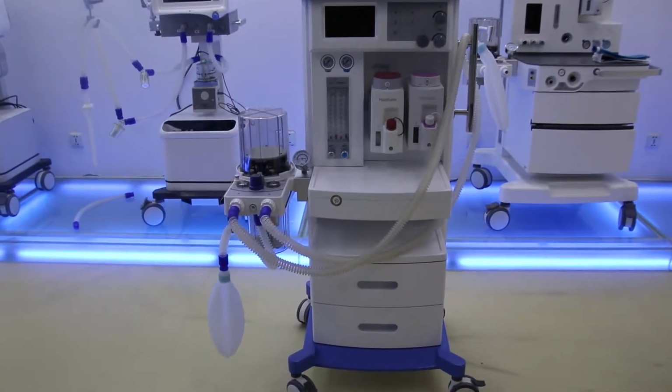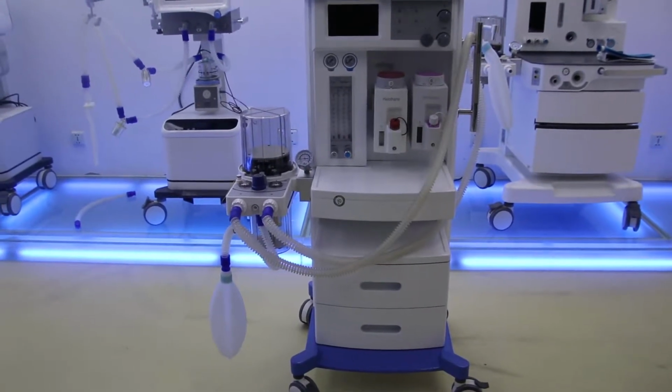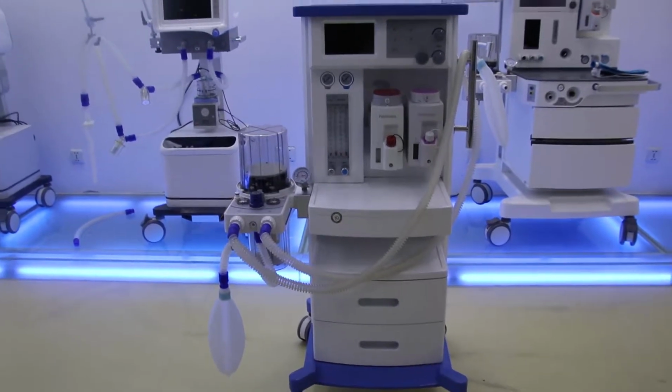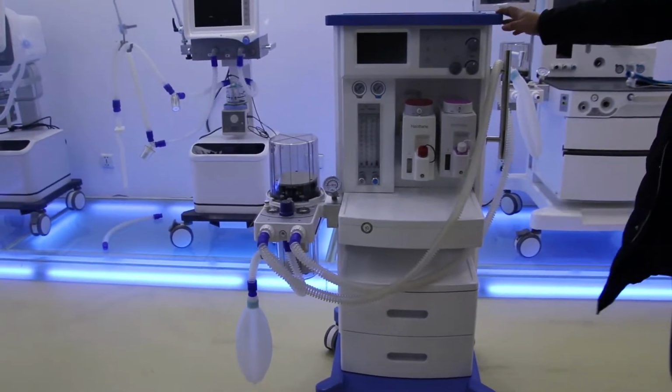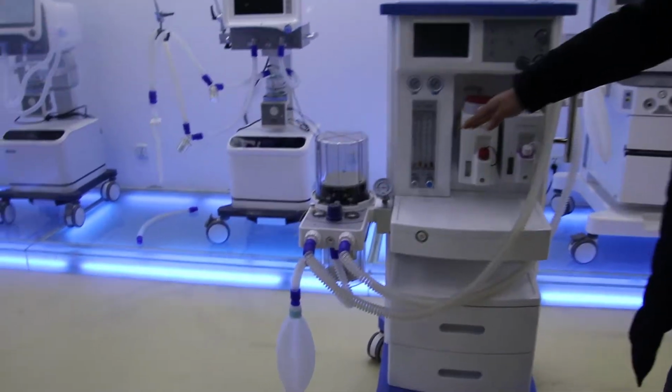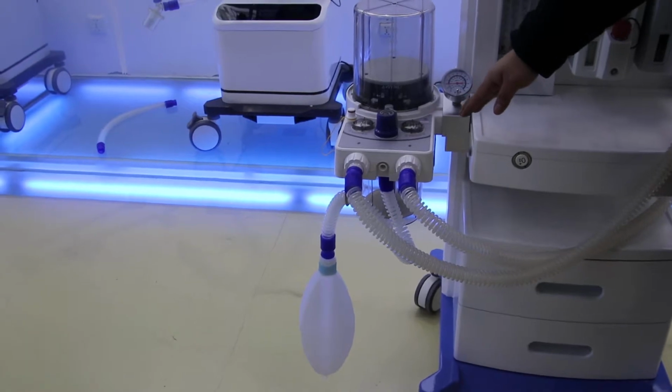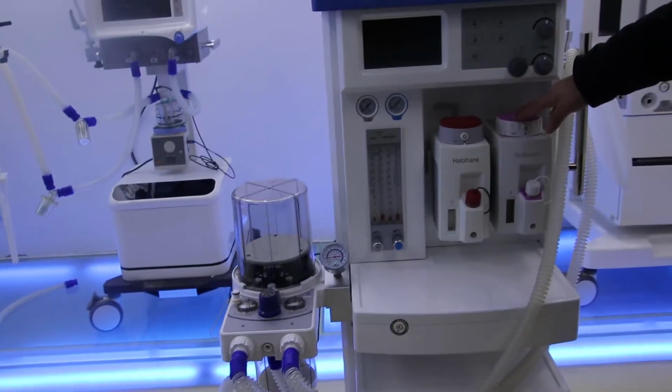This is our S6100D anesthesia system. For this machine, let me first introduce the components. We have the main frame, and then the breathing pipeline. Here is also the bellow and the CO2 absorber. And then you can see here is the anesthetic vaporizer.